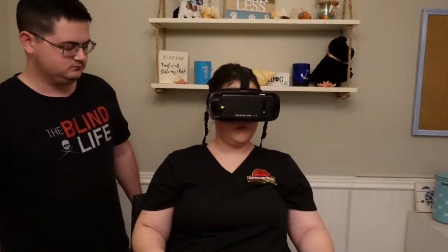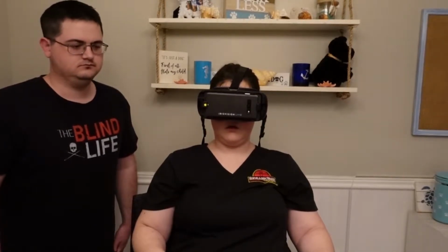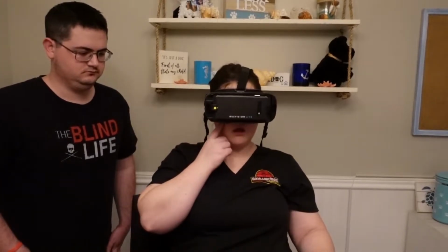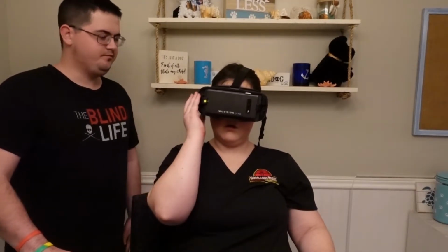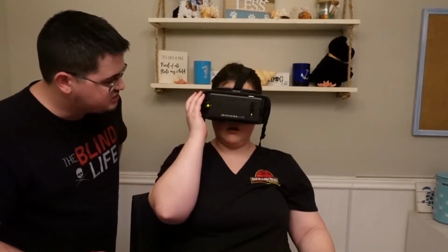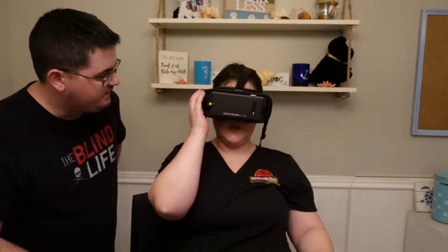With scene with bubble, this allows you to increase magnification within a section of the screen. This prevents you from losing the context of your surroundings. To increase the bubble size, you would swipe up on the touchpad. To decrease, you would go down. What he means is the pad where you would double click, swipe up like you would with VoiceOver. So I swiped up and now I'm swiping down.